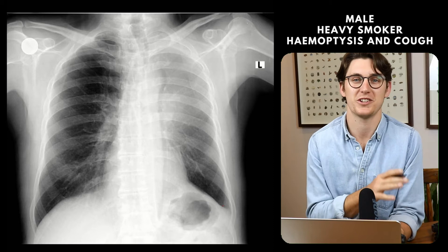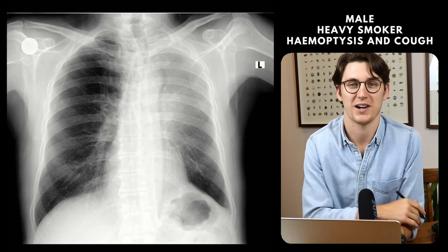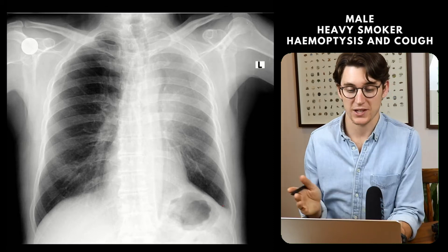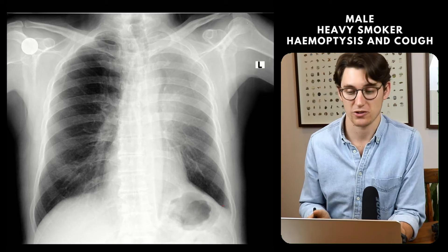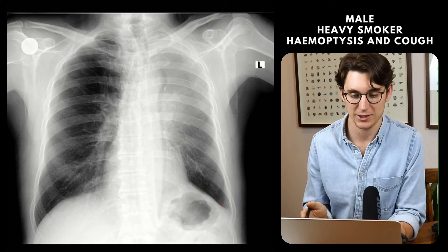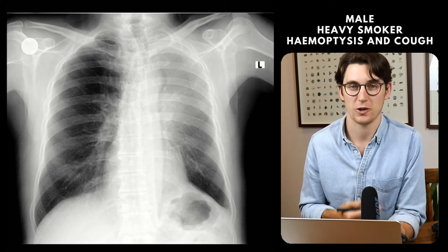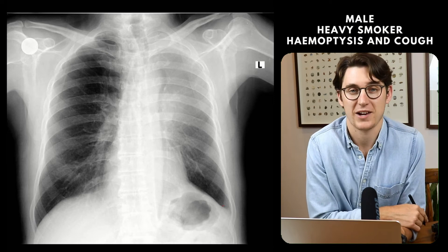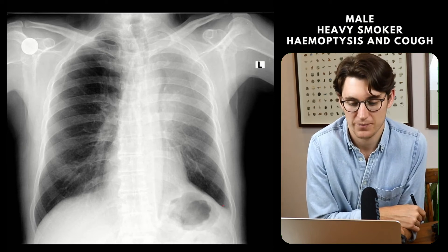Go ahead, pause the video, come up with your summary and join me for my approach. I'd start by saying this is a frontal chest radiograph of a skeletally mature male who presents with hemoptysis and a cough on the background of a significant smoking history.